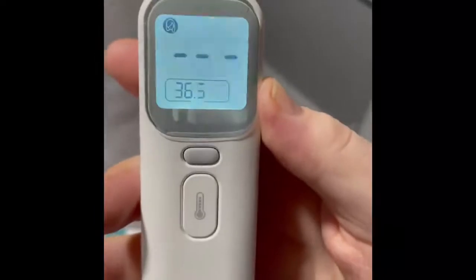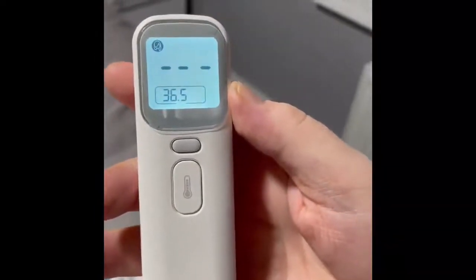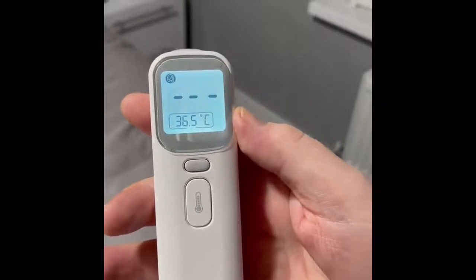So I'm going to power the unit on, and I'm going to hold this approximately 1 inch away from my forehead and just push the button, and it's taken my temperature, as you can see. And now what I'm going to do is I'm going to remove the cover, the magnetized cover, and do an ear temperature to see how that works as well.